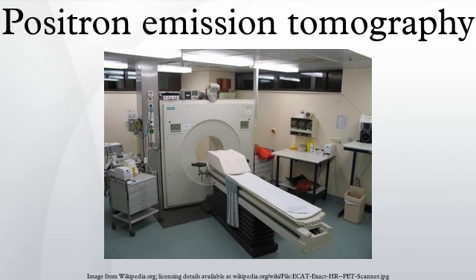PET is a valuable technique for some diseases and disorders, because it is possible to target the radiochemicals used for particular bodily functions. Oncology.